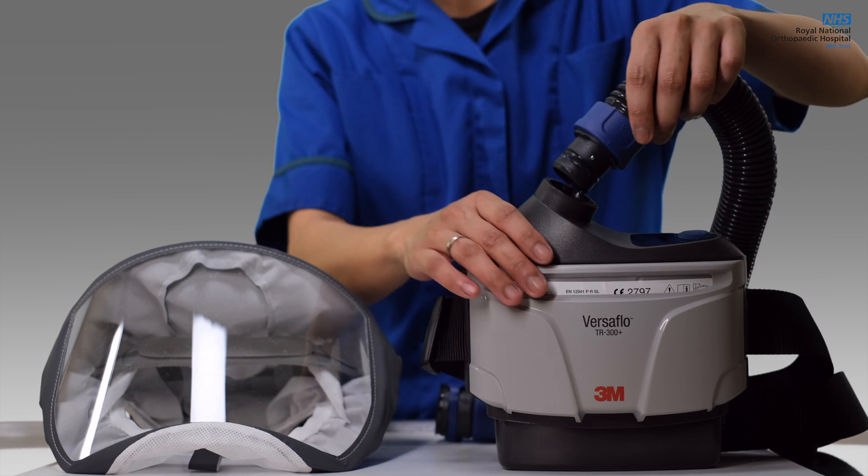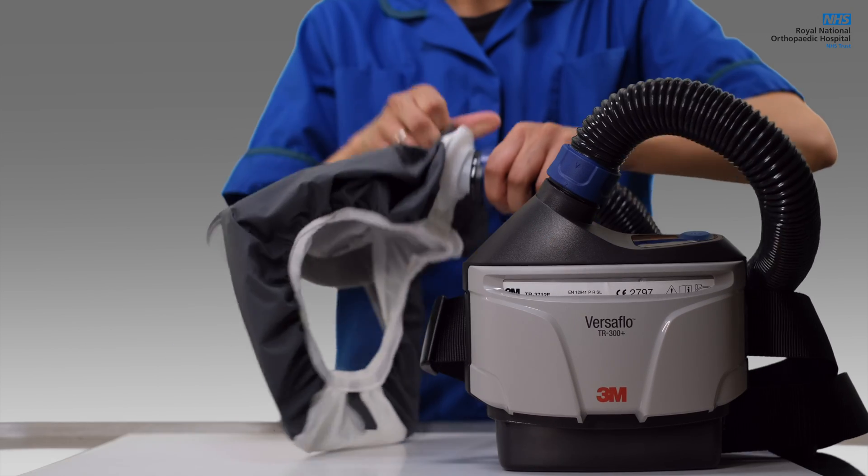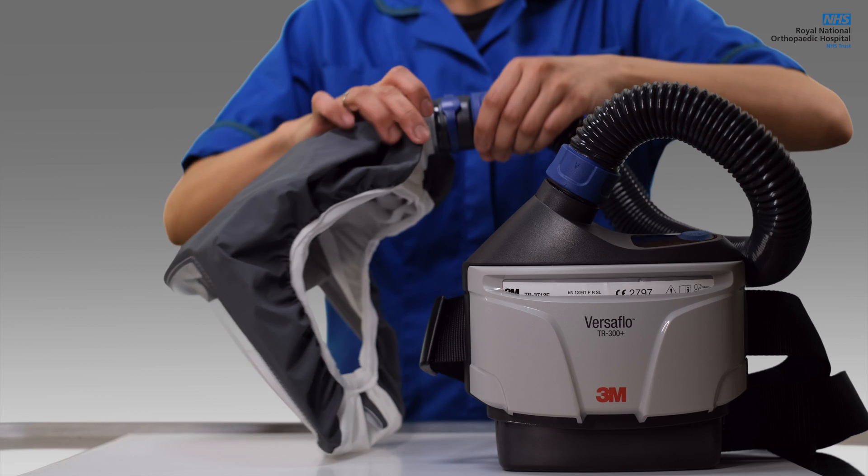Insert the hose into the unit and gently pull to ensure that it is fitted firmly. Insert the other end of the hose to the hood and do the same.